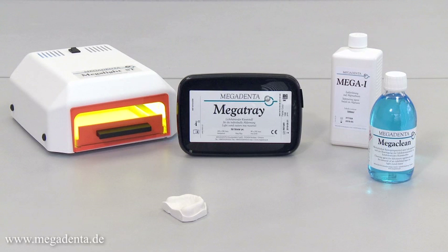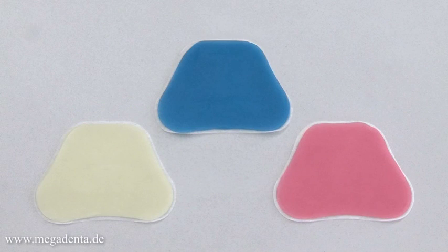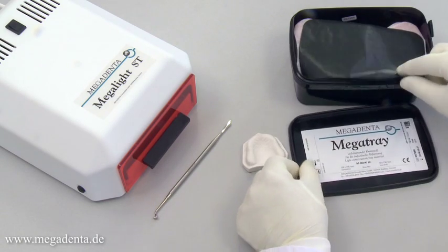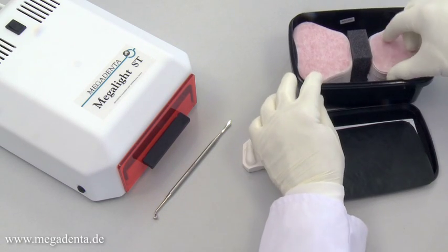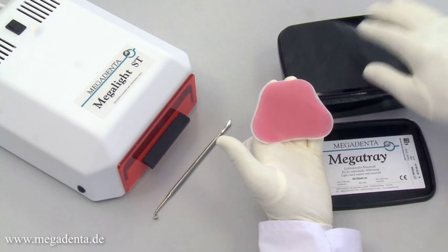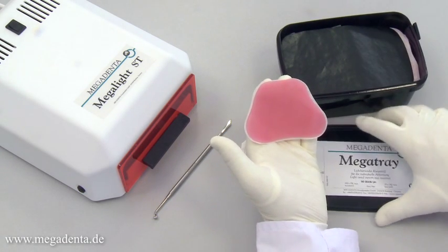Megatray is a light curing tray material for the fabrication of individual custom trays in dentistry. Megatray is available in three colors: blue, pink, and transparent. The Megatray wafer can be taken out of the light protective box easily. To avoid any pre-curing of the material, please close the box immediately after taking out the tray wafer.